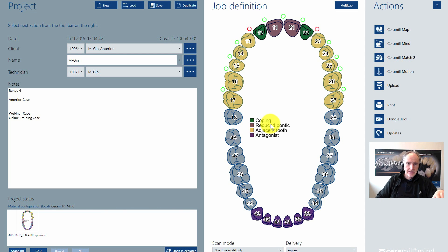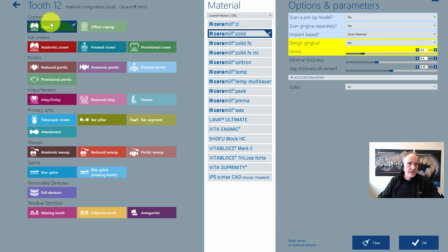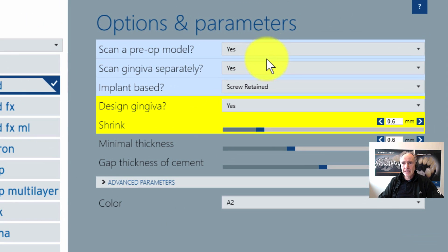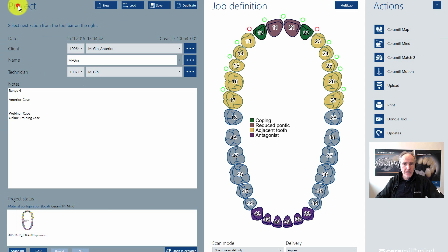First I want to show the patient's card and how it looks. You see this is the anterior bridge from 12 to 22. Let's click on tooth number 12. This should be copied in a solid material for example. What's important to know is that we have a pre-op model, a separate gingiva scan, and we want to make a screw retained bridge with a gingiva design. If you click yes here, then you are wizard-guided through your construction with the gingiva parts. So let's go in and start with the construction.